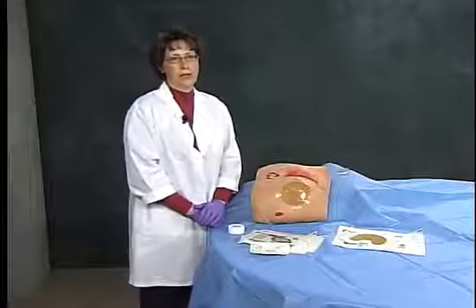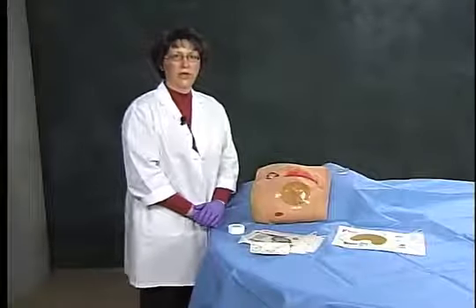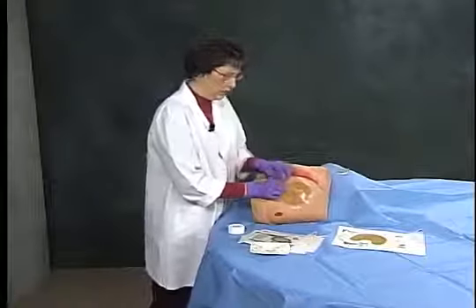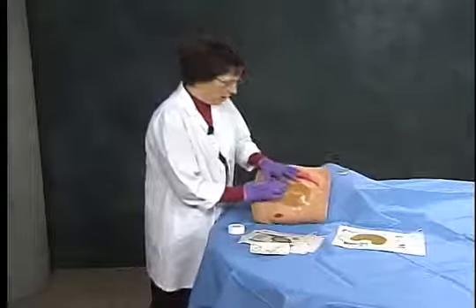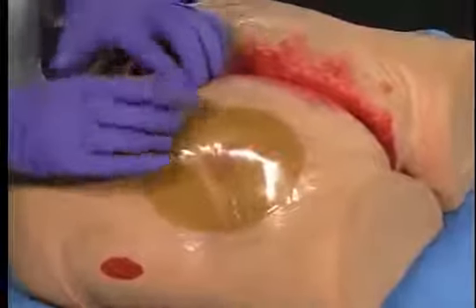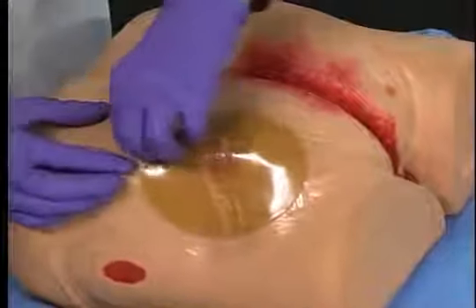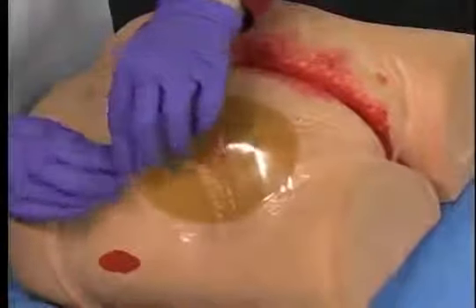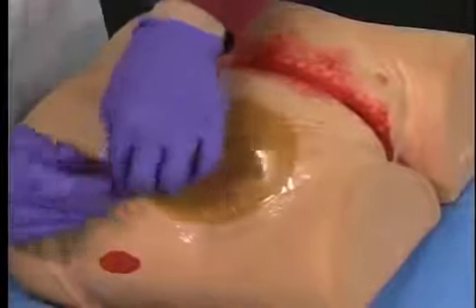I will now go on to demonstrate the dressing removal. You will carefully lift the dressing edge of the film border while pressing down on the skin. Continue to lift the edge until all are free from the skin surface.